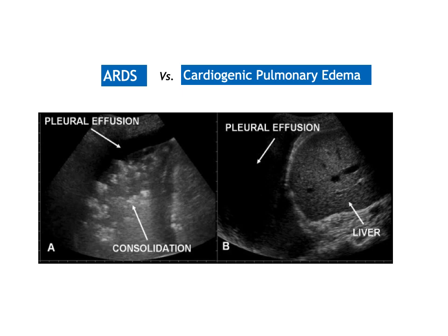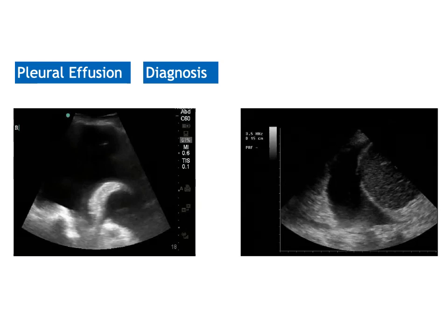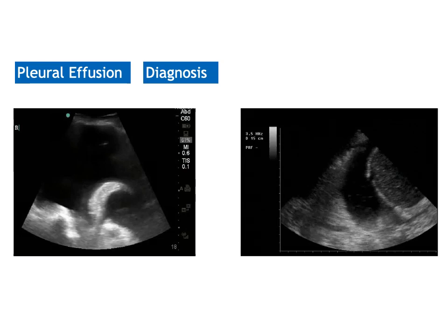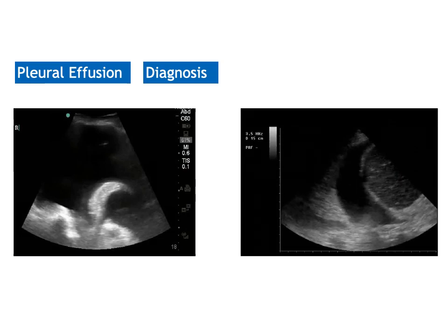But again, this is an ARDS. On the other hand, in pure hydrostatic pulmonary edema, you should not see consolidation unless there is a superadded infection on top of the heart failure condition.